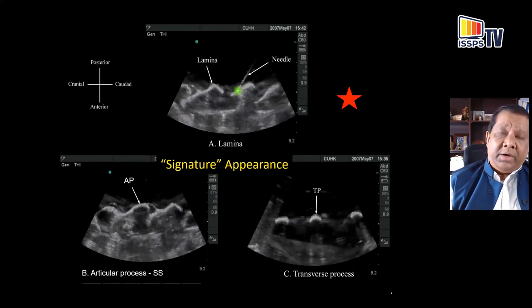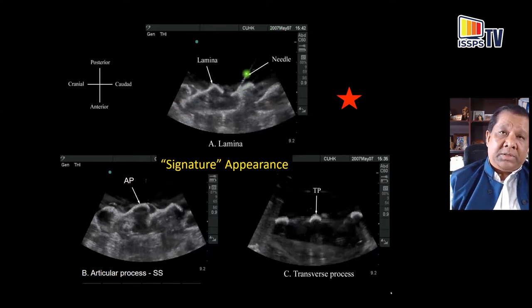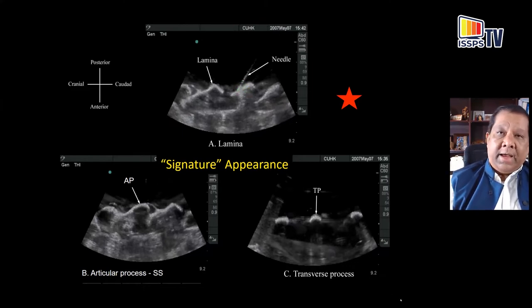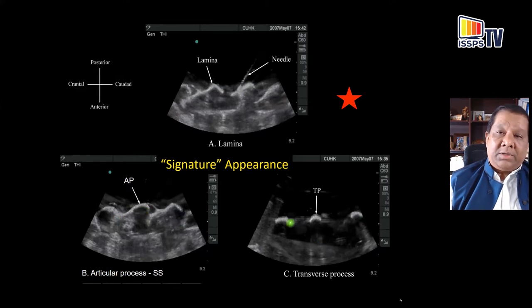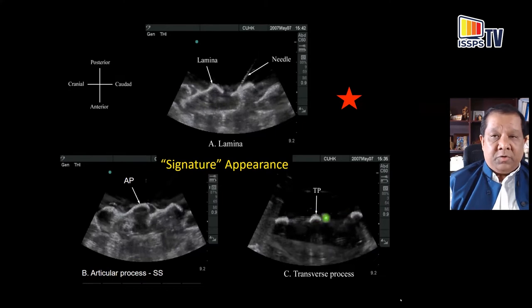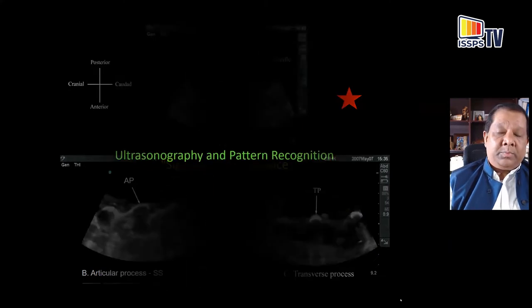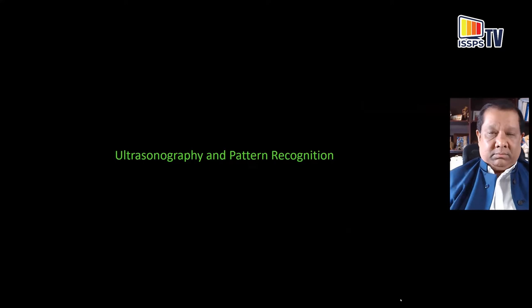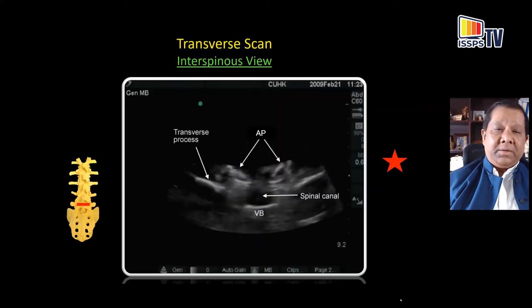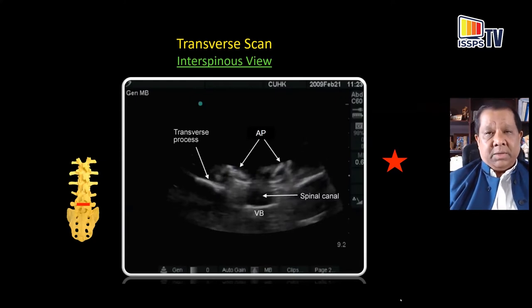The water phantom is quite a useful tool because you can see through water. For beginners and novices, if you place a needle on a structure and perform the scan, you can immediately validate what you are seeing on the ultrasound scan — identifying what a lamina looks like on a sagittal view versus what an articular process looks like. Ultrasonography of the spine is largely a case of recognizing patterns, and a few key patterns emerge from early observations of these images.